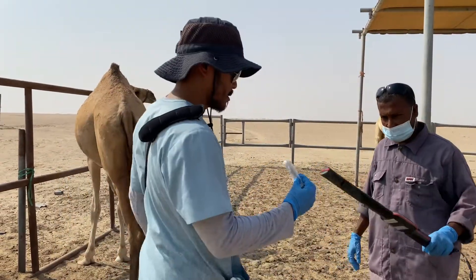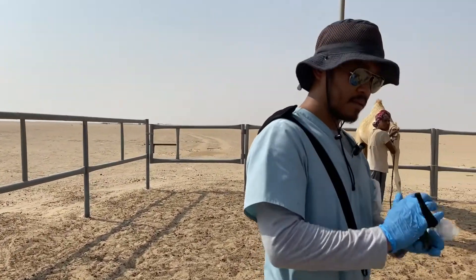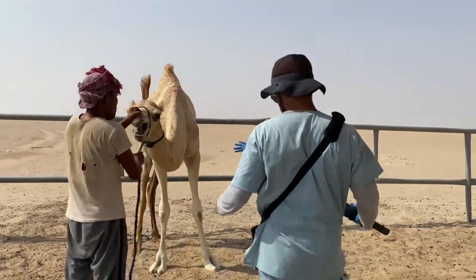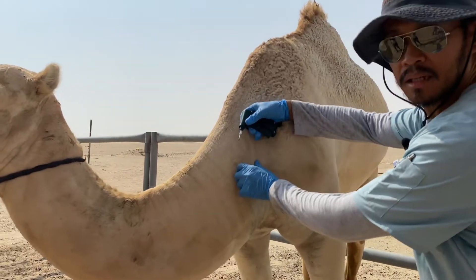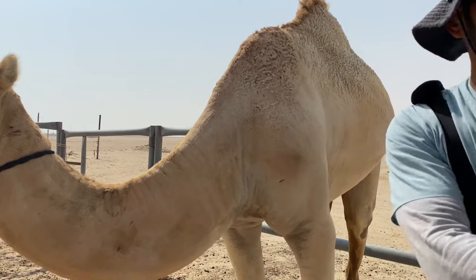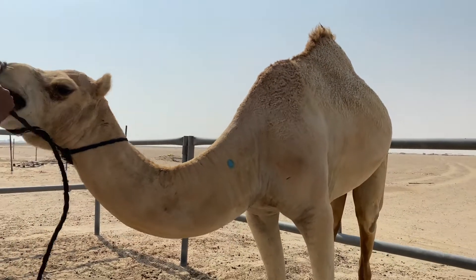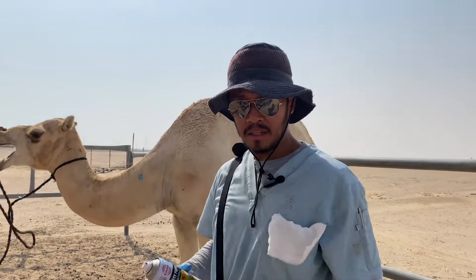Here is the microchip again. Put it on the owner's name, place it on the applicator like so, remove the cover. We need to restrain the animal, and then as you can see, this is where we put it. Then we check it and put spray so we know that this animal is done, and then we release the animal. That's how it is done — I'll show you again on another animal.